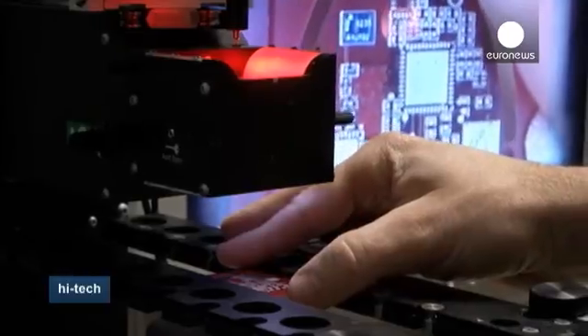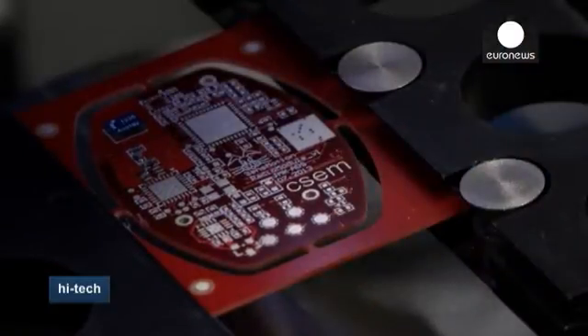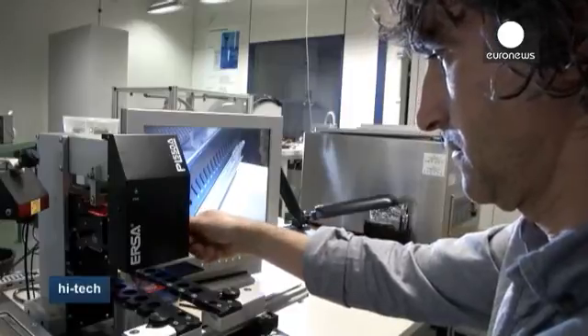From images to reality — it's impossible to assemble devices so small with your hands, so engineers use a microscope to magnify the tiny electrical circuits and then, with the help of a special machine, place them on the support.